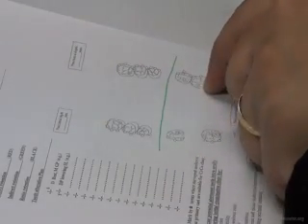If I could not place the rest on the mesial of 8, because it would be too bulky inside the mouth, I could put it on 7. Either on the same tooth on the other side or at least one tooth before, but not more than that. So I have two options: putting a rest on the 8 and doing the double Akers here, or the rest on the mesial of the 7, a double rest, mesial and distal of the 6 as well, and double Akers. These are all options.